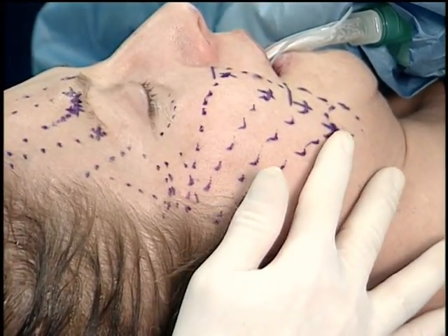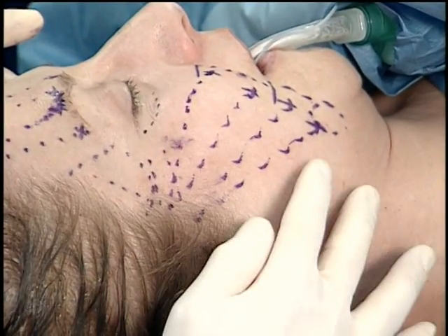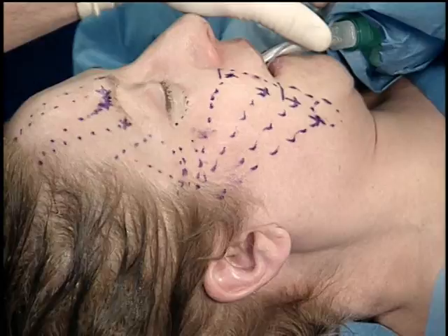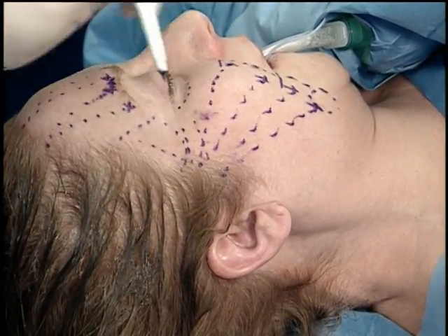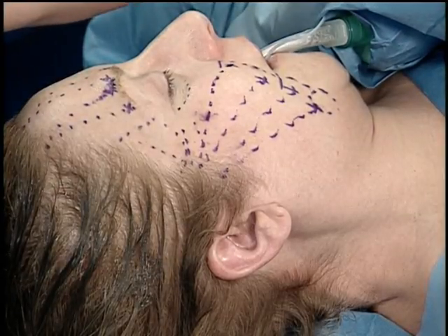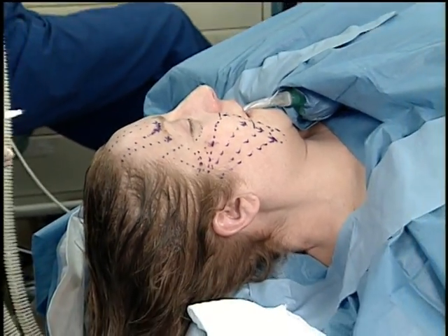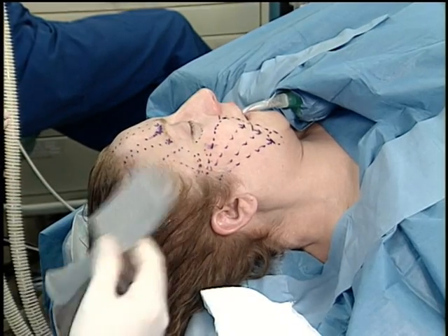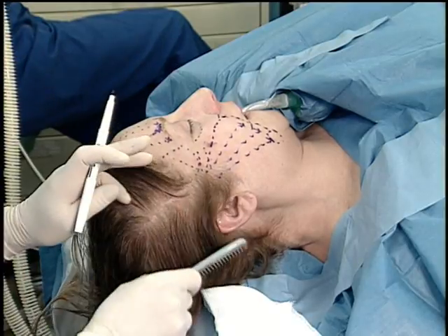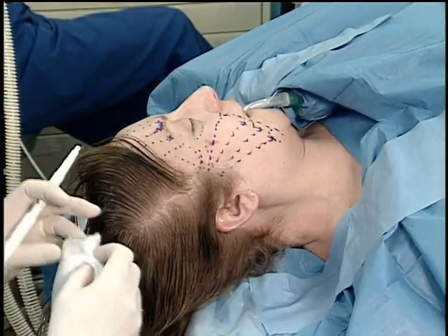Now, to create a strong jawline, we want to pull as much as we can posteriorly the face up into the hair and posteriorly along the jawline. In order to deploy the full strength of the articulus thread, I try to take most of the excess face up into the scalp first. And in order to do that, I do a temporal scalp thread that is very, very safe using the articulus contour structure. So we get the hair out of the way, and remember, my goal is to pull as much of the face into the hair as possible, so I minimize the bunching of the tissue, the Venetian blinding of the tissue in the hairline.